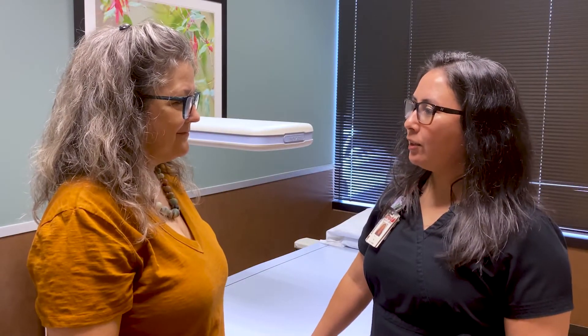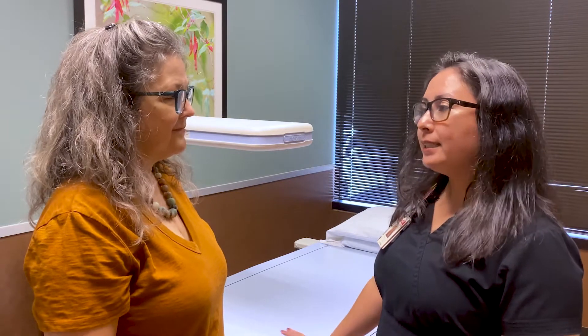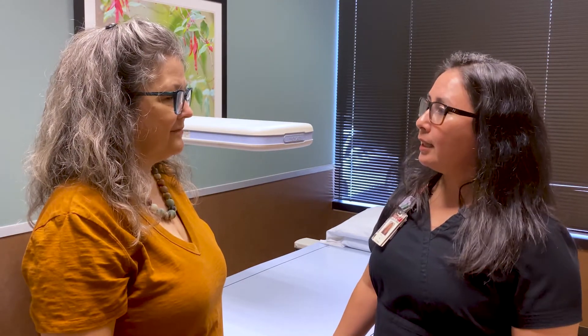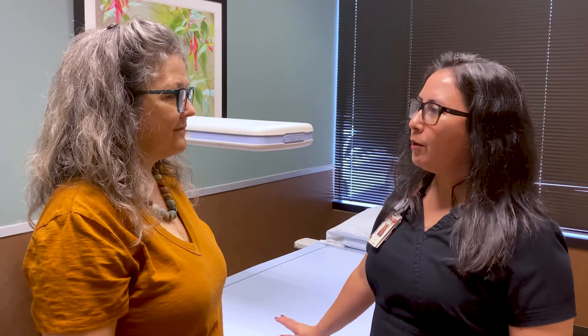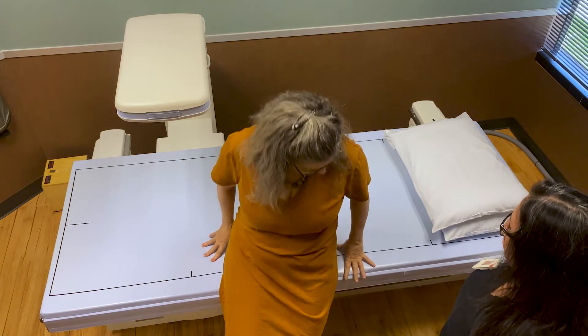Now that we've taken your height and weight, we're going to start with the exam. I'm going to have you lay on the table. We're going to take a couple of pictures — one of your left hip and lower spine. Each one's going to last about a minute. You can breathe through the whole thing. Go ahead and lay on your back as straight as you can.